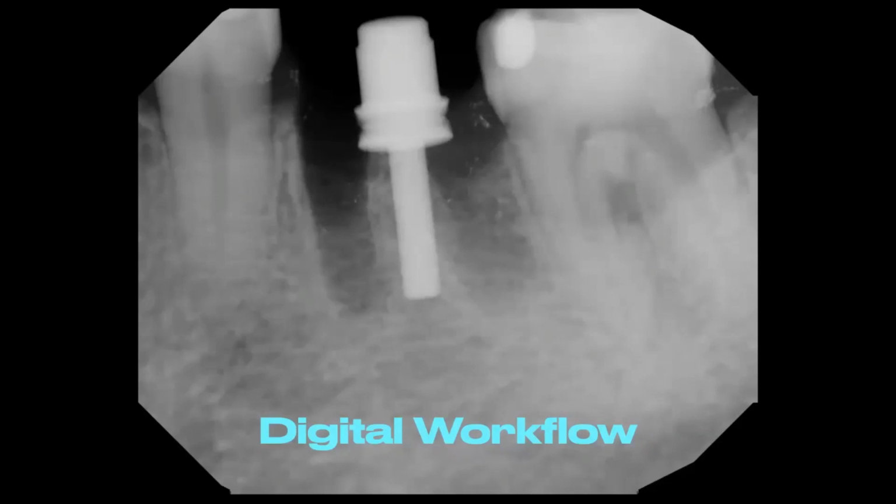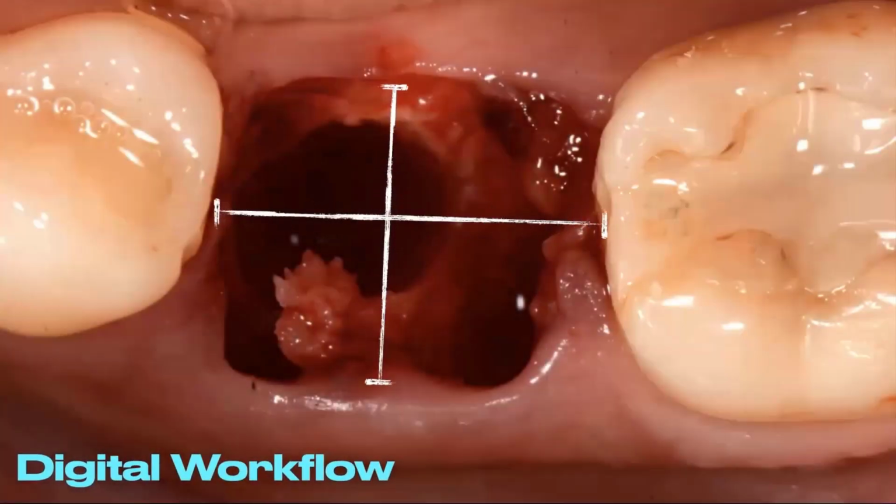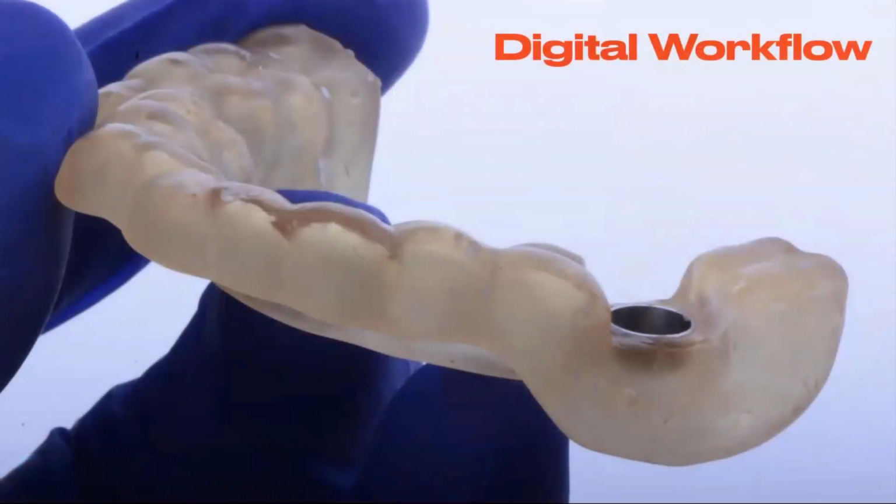And so this is how cone beam fits into all this: it allows us to be very, very accurate in our implant placement and our surgical interventions. So in a case like this, for instance, we're going to place an implant in that area, we've drilled our osteotomy. There's our 3D printed guide, so we know it's there.